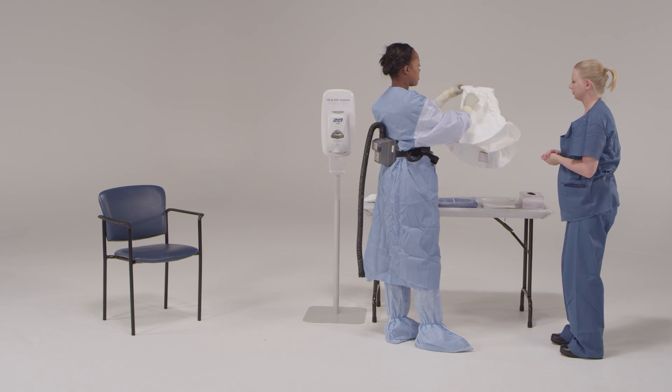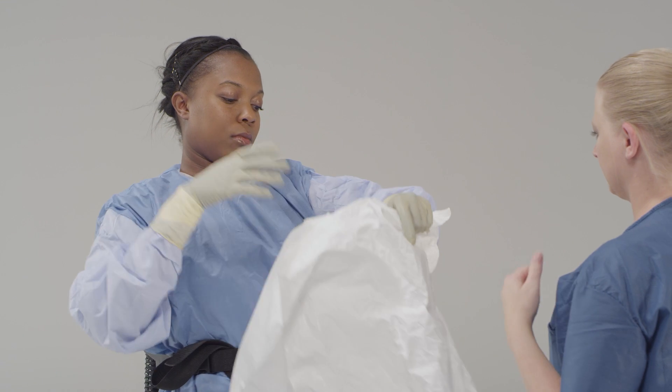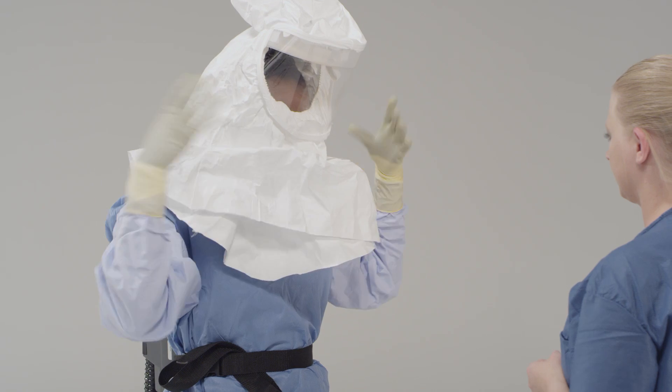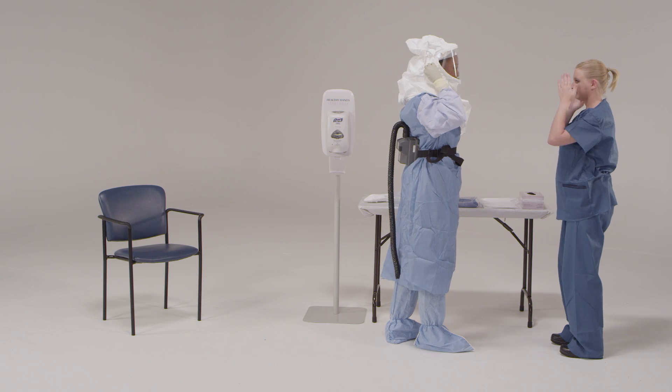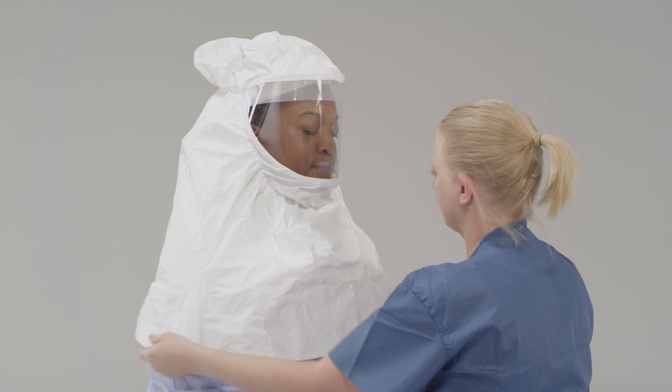Put on the single-use PAPR hood that fully covers the neck and extends over the shoulders. Be sure that the hood covers the head and all of the hair, neck, and ears, and that it extends past the neck to the shoulders. Depending on the type of PAPR unit, the outer apron may need to be put on first.